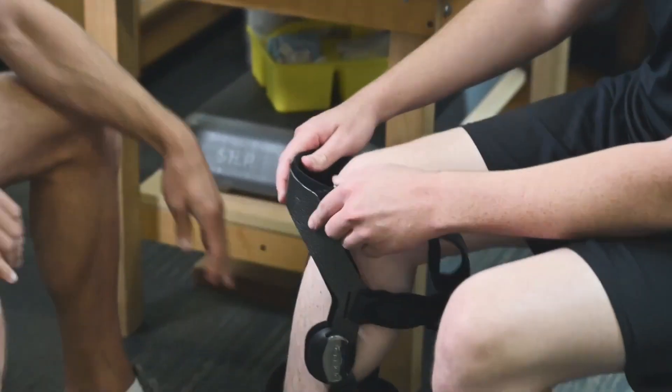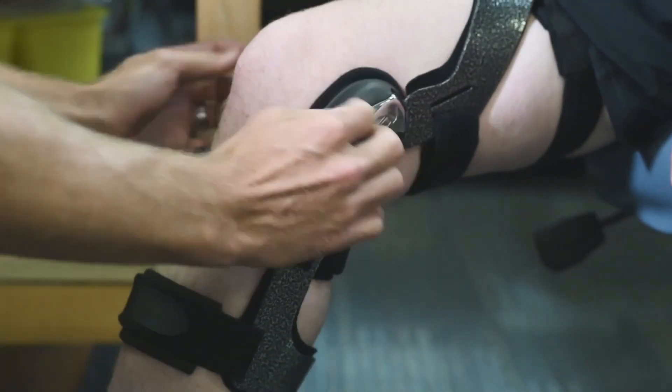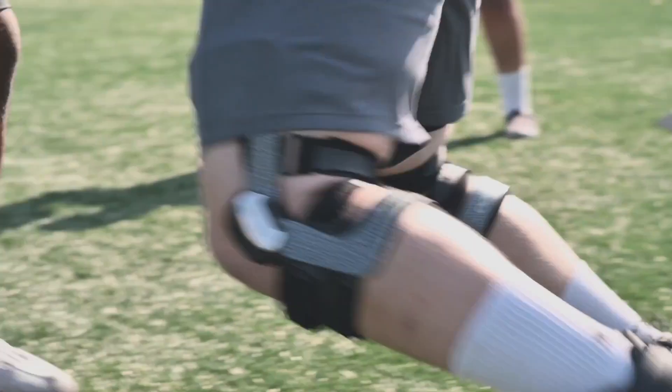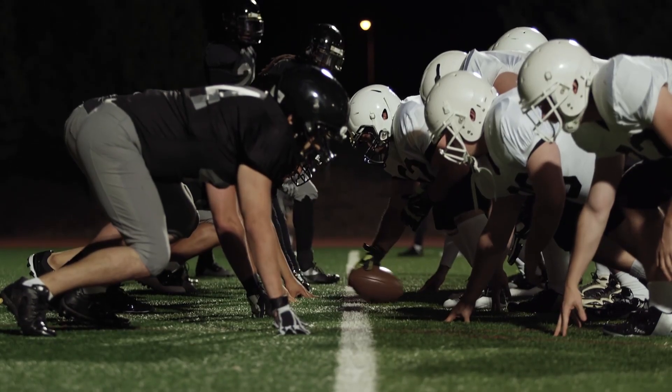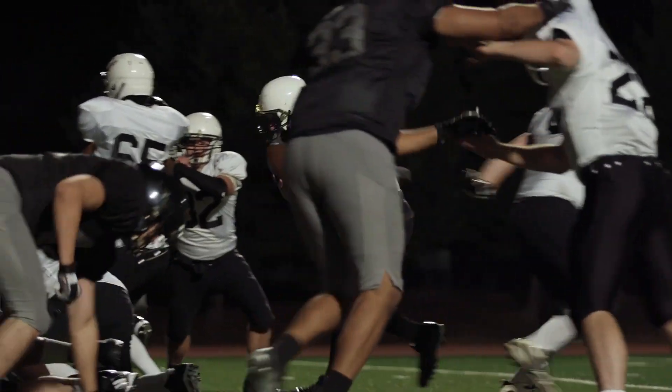The Armour brace has been just awesome for our kids to wear. They like it. It looks cool. It's what the D1 and the pros wear, but it's also very, very practical and protective for their knees. Adding that preventative measure with the prophylactic bracing, specifically the Armours, has been awesome for greatly reducing MCL and collateral ligament damage and injuries with our football athletes.